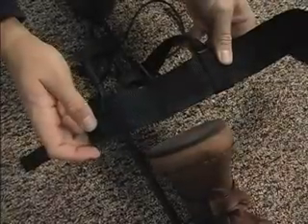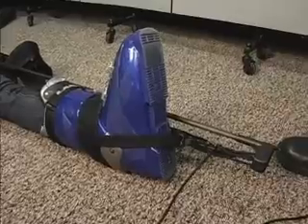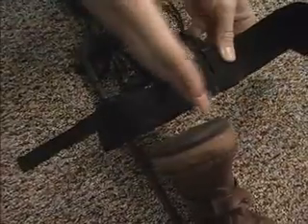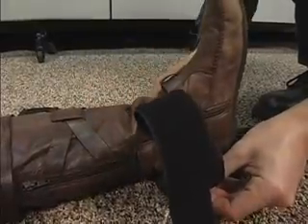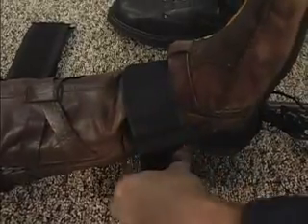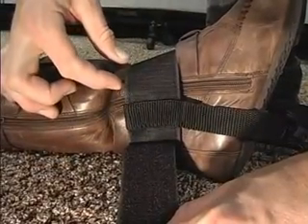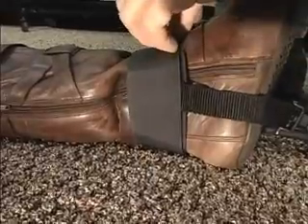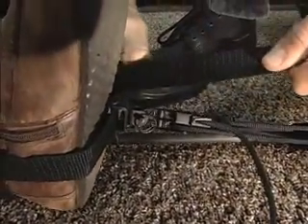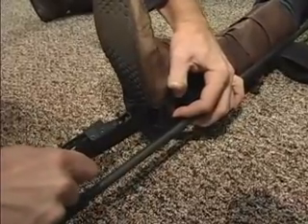Apply the ankle hitch second. The ankle hitch has been designed to accommodate a wide range of sizes, from a pediatric shoe to an adult ski boot. Unwrap the Velcro strap and align the hitch with the patient's leg. Gently lift the patient's foot enough so that the hitch can be slid under the patient's ankle. The thicker strap should be positioned to be wrapped around the patient's ankle directly above the foot. The second strap should run beneath the patient's foot and be aligned equally on opposite sides of the ankle. If this strap is uneven, slide the loose end along the ankle strap so that it is aligned equally on both sides of the patient's ankle. Once complete, the strap should be tightened to minimize the distance between itself and the bottom of the patient's foot, by pulling the loose end of the strap coming from the buckle attached to the ankle hitch.